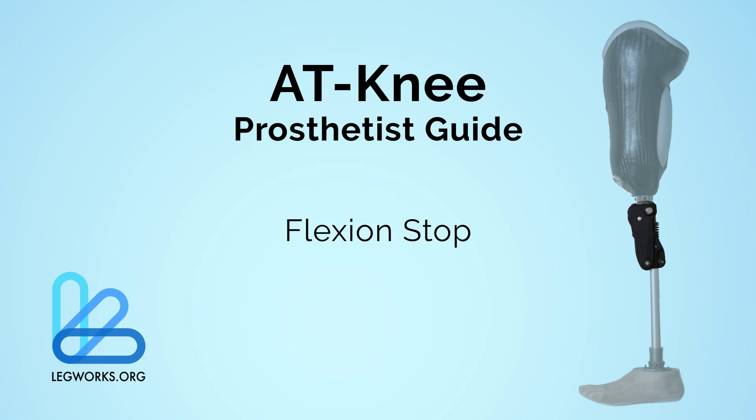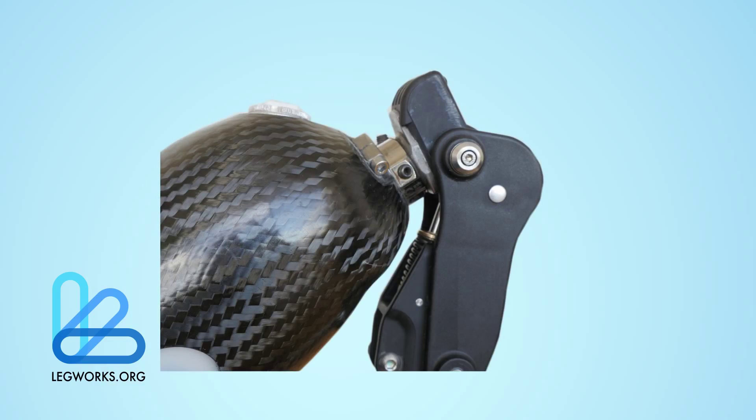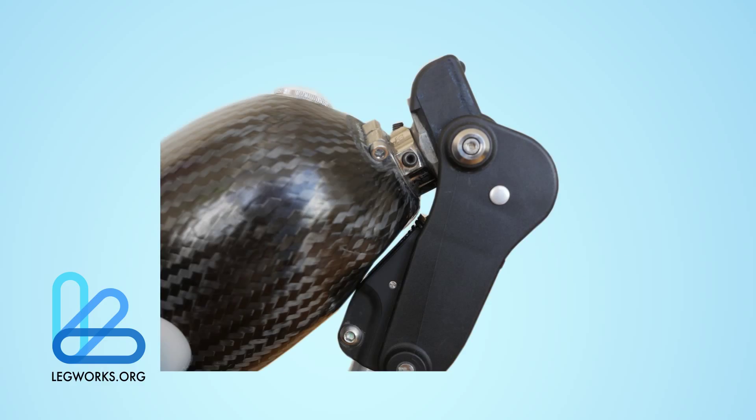A flexion stop is needed to prevent damage to the internal knee mechanisms. When fully flexed, the socket should not hit the extension assist mechanism in any way or have it be used as a stop. Instead, the socket or thigh portion of the prosthesis in case of short sockets should come to rest against the bottom molded pylon adapter part of the knee.